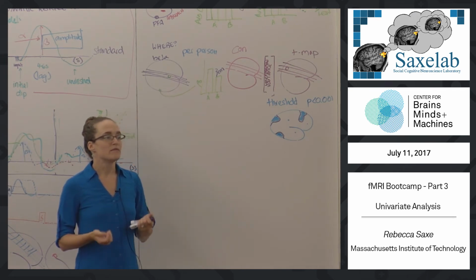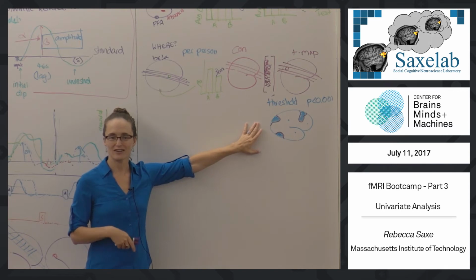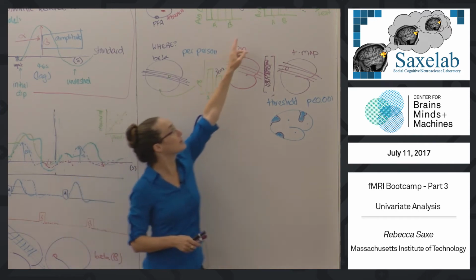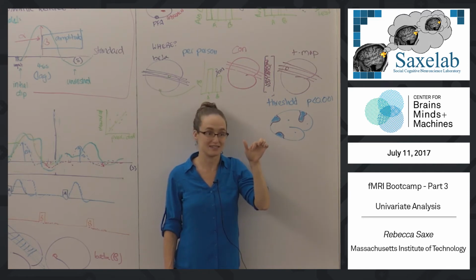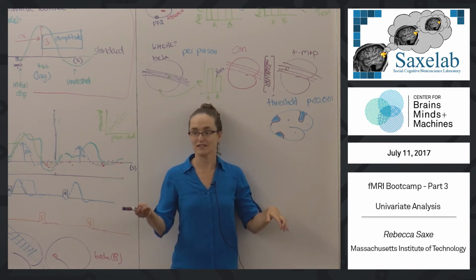Okay, the most basic next question is, is that just that person, or is that stable across people, right? And so the most standard thing you might want to do, just like we did up here, is a t-test across people, where we ask whether it's not just that this one person's amygdala prefers faces to scenes, but that everybody's does. Here now we're looking at verbs and nouns all over the brain. Is it just this person who has regions in these places that respond more to verbs than nouns, which could be something about that individual human or could be noise in that scan session?